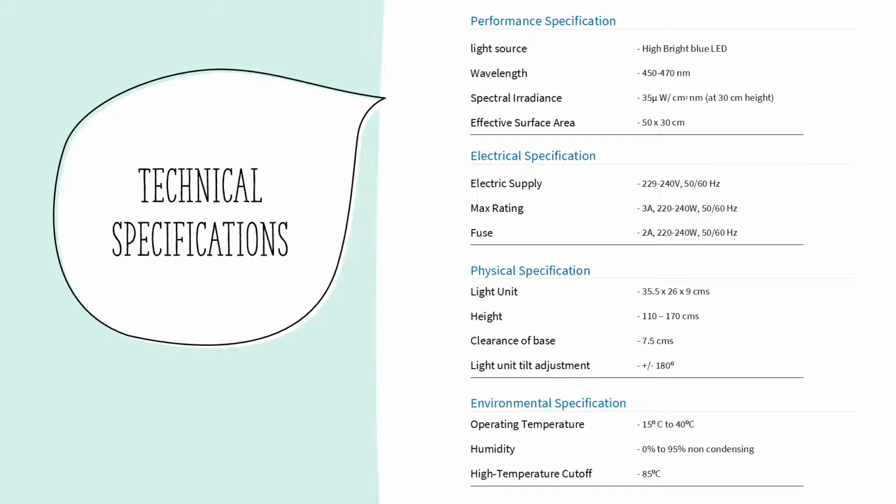In the environmental specifications, operating temperature from 15 Celsius to 40, and the humidity from 0 to 95 non-condensing, and the high temperature cut off from 85 Celsius.